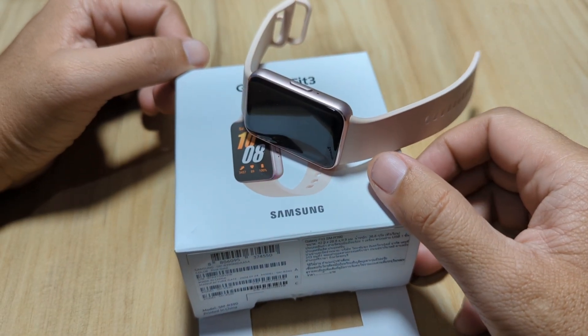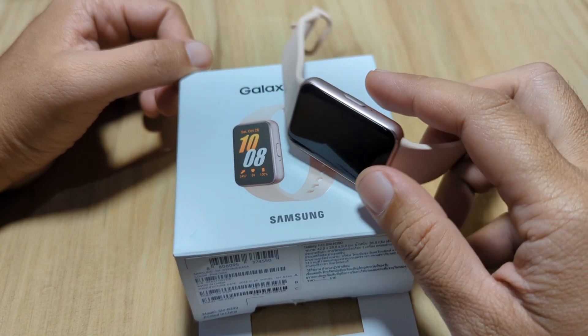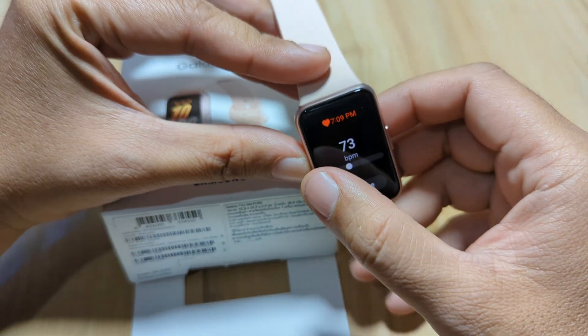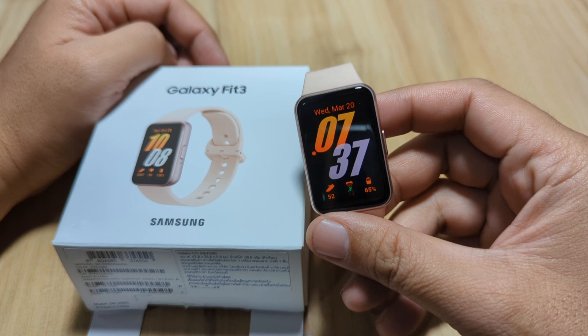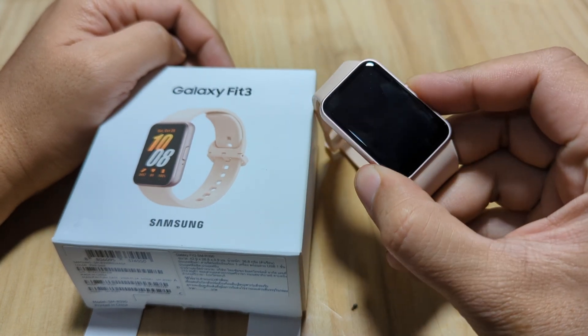Good day, this is smartwatchspecifications.com, the premier site for smartwatch specs, news and reviews. Previously, we already checked the heart rate monitoring of this fitness tracker, the Galaxy Fit 3, and we compared it with the Apple Watch as well as the Xiaomi Mi Band 8.